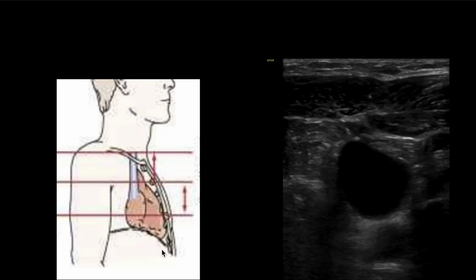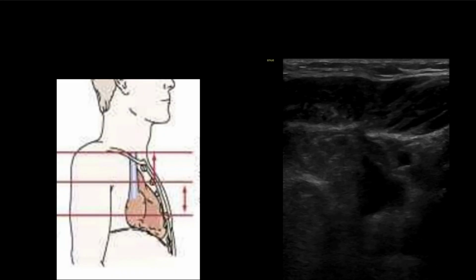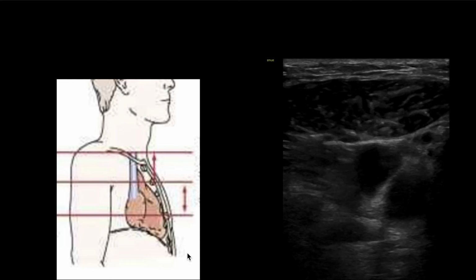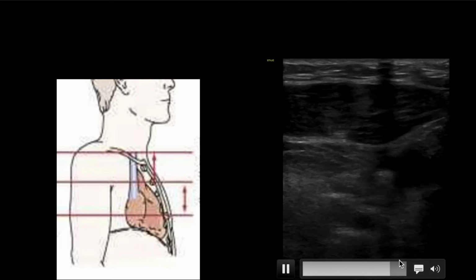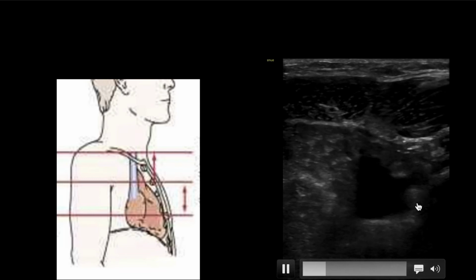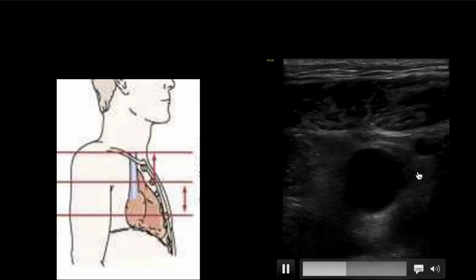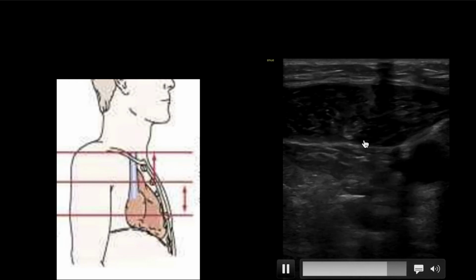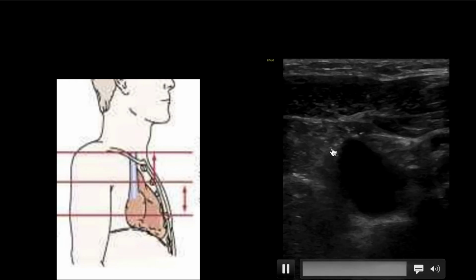So this is a great time to use our jugular venous ultrasound exam. And so again, this patient's sitting upright at 90 degrees in a chair. When this starts over, we start low at the clavicle right here. Look at this big IJ, and then we're going to slowly slide up. And you see the IJ is getting closer to the size of the carotid. As you slide a little bit more, here's this beautiful collapse point. We found the collapse point.